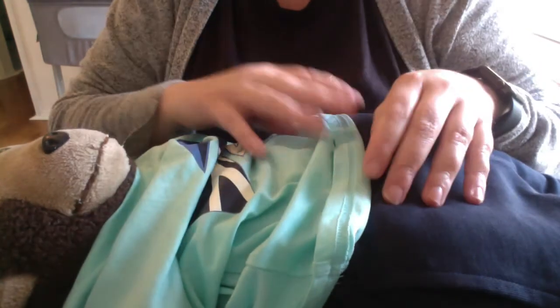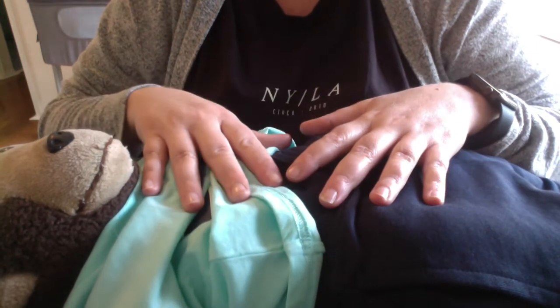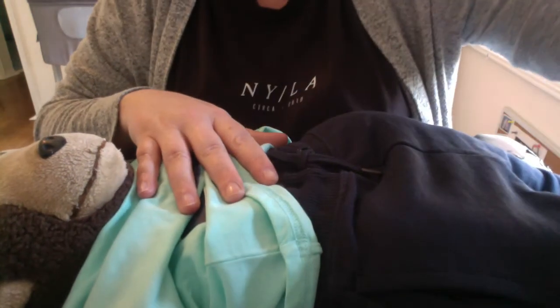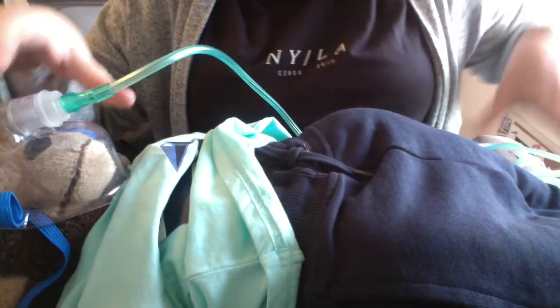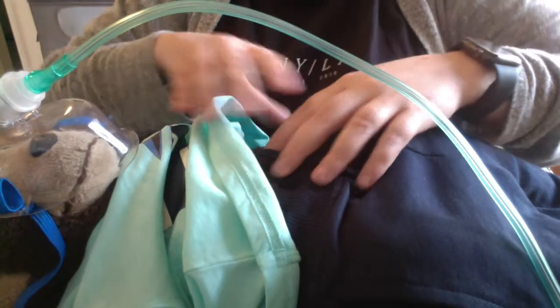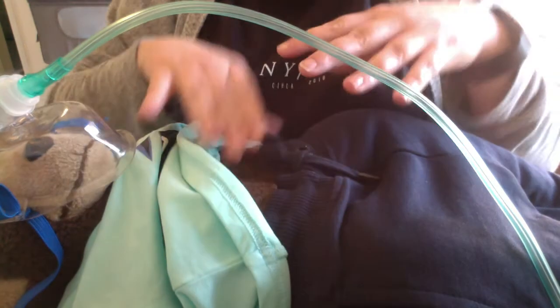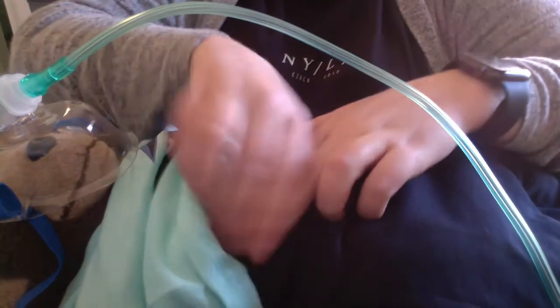Once all those have been put into consideration and we have confirmed tension pneumothorax, the patient probably would already be on high flow oxygen, but we'll just place him on high flow oxygen like that. And then provide ventilatory assistance if required. We would then expose the side of the tension pneumothorax so we could work with it.